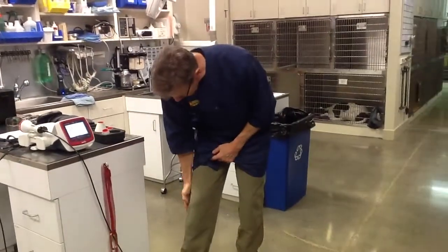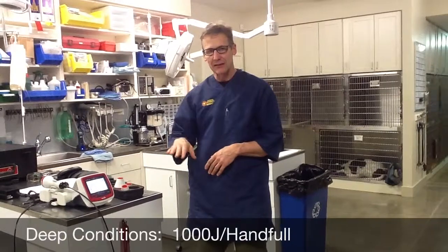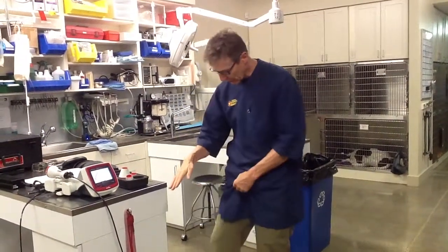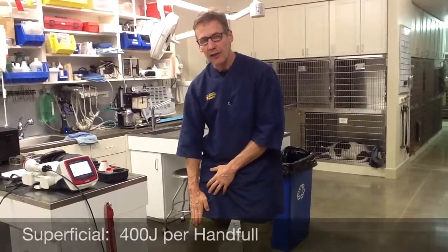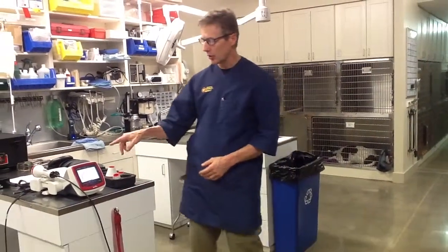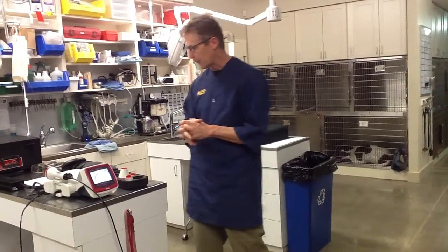So if I do my knee — 1,000, 2,000, 3,000, 4,000 — about 4,000 to 5,000 joules is what my knee would take, because it's a deep structure getting 10 joules per square centimeter over about 400 square centimeters. If I was treating a wound on my leg the size of my hand, that would only be 4 joules per square centimeter, so 4 times 100 equals 400 joules. You should have a rough idea — is that dog's hip around 3,000 joules? Is that skin wound around 200 joules? You should be double-checking what dosage the laser is coming up with.